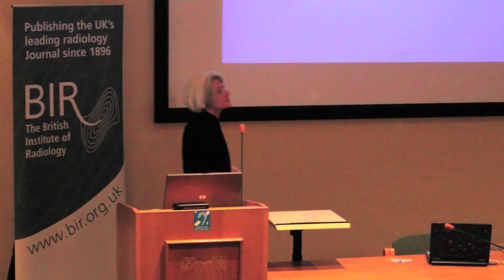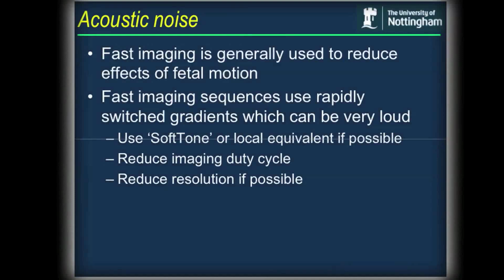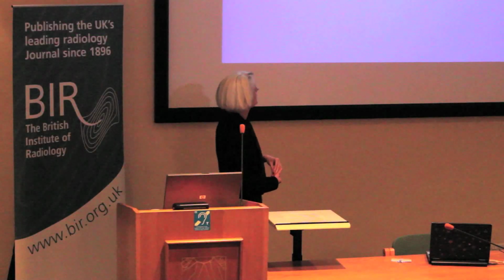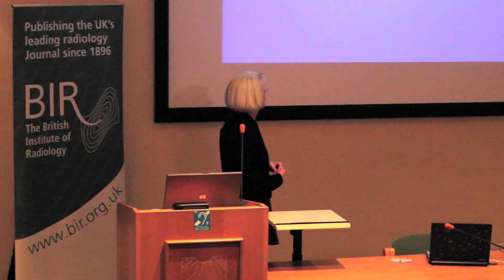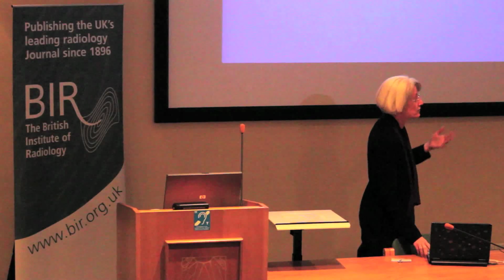So of course, again, we use fast imaging to reduce fetal motion, and fast imaging sequences use rapidly switched gradients, which cause increased noise. So one way to reduce it is to use the equivalent of soft tone, or whatever your manufacturer uses, to reduce noise, but that will always lengthen the sequences, so it's probably not practical. Again, reduce the duty cycle, or reduce the resolution. But all these things will reduce image quality. It might be better just to do it quickly and get them out.